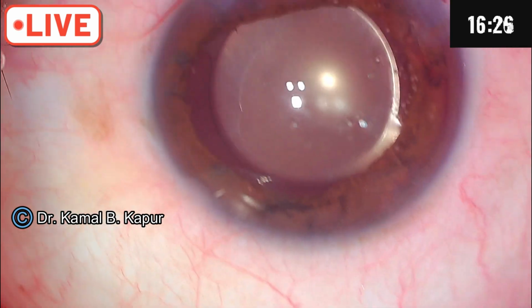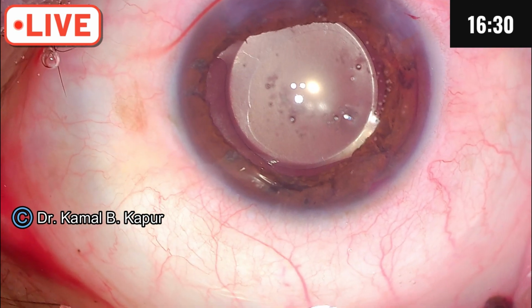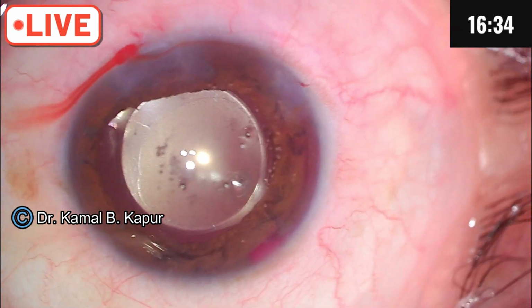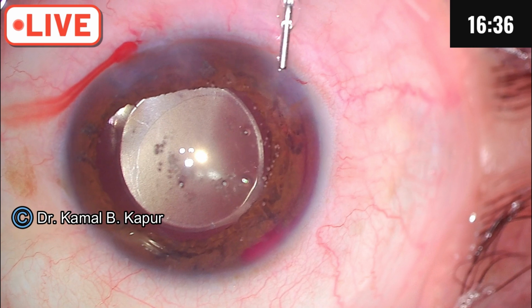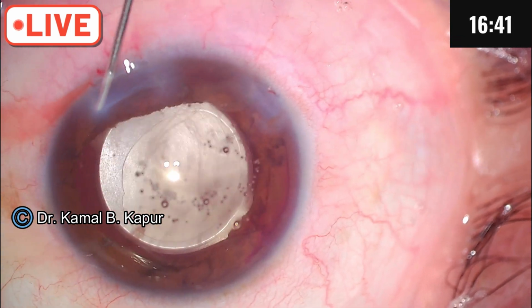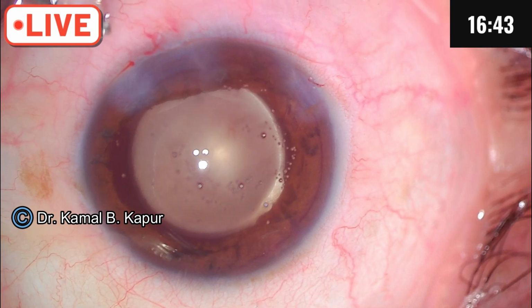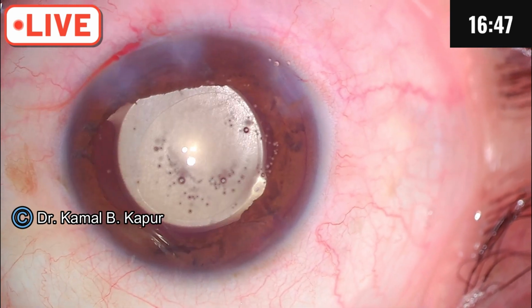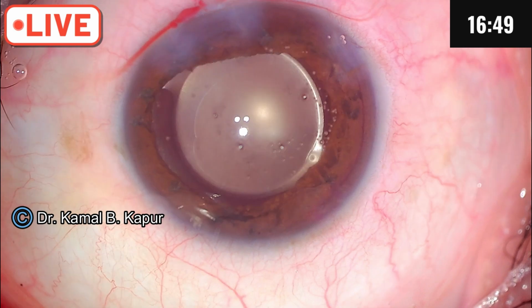What you're seeing, a little bit of haze you're seeing, is due to some amount of ooze coming in from there. So we wait for the ooze to settle down.